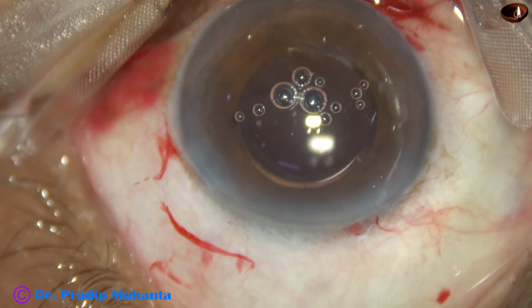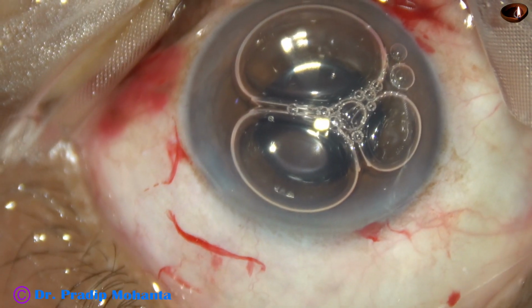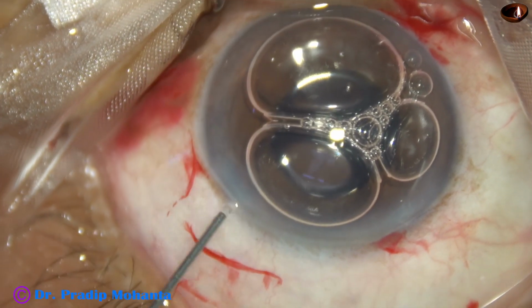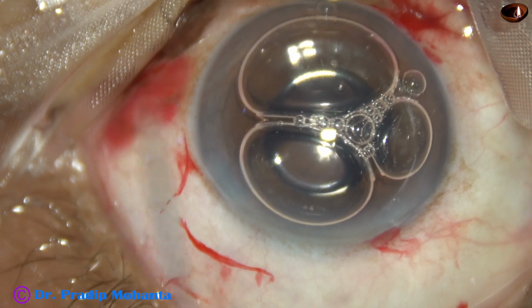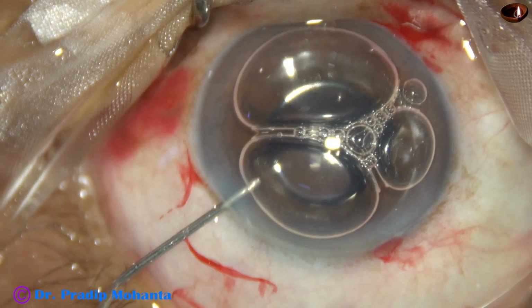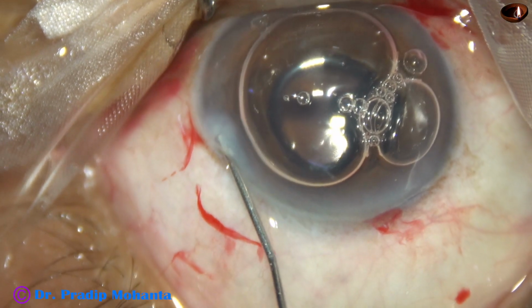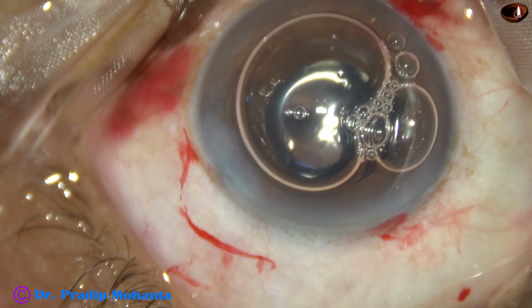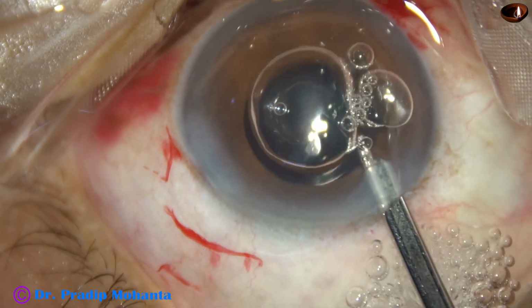Yes, some vitrectomy has been done, some more air, and this is pilocarpine. The side port is, this is moxifloxacin, and now the side ports are closed by hydrating corneal stroma. And a final lavage of the anterior chamber.